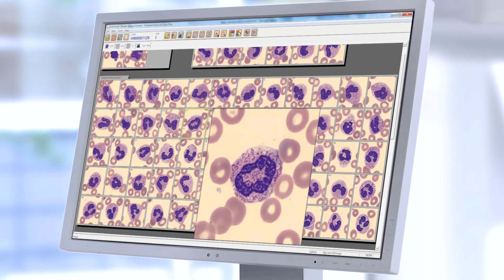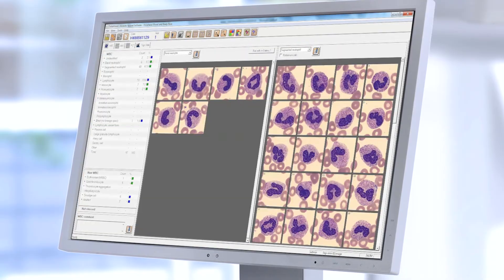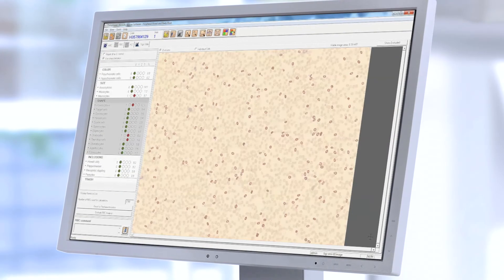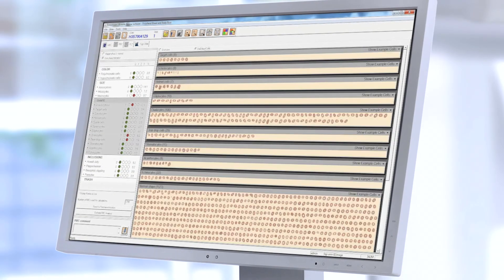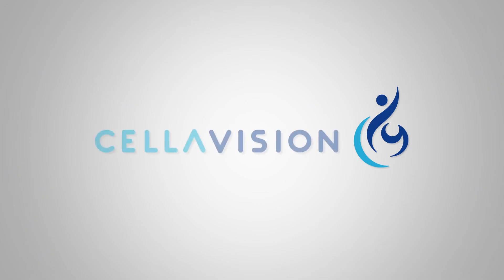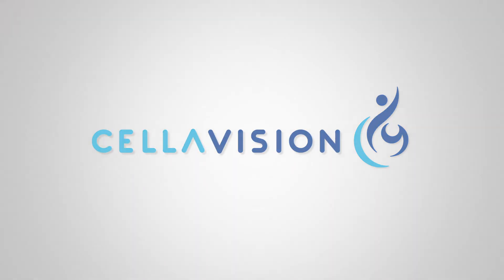Structured interfaces, smart functionalities, and embedded tools help speed up the review process while promoting accuracy and consistency. Work smarter and perform better with CellaVision.